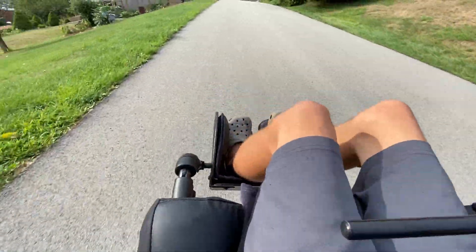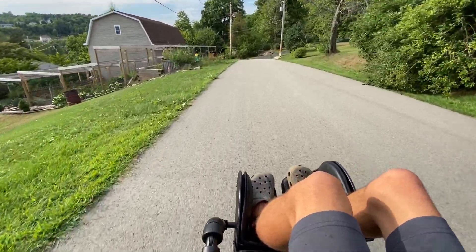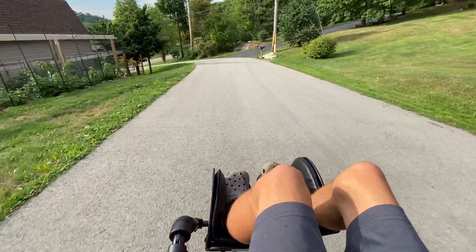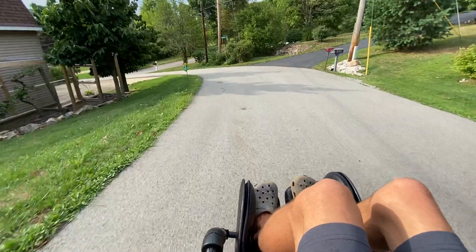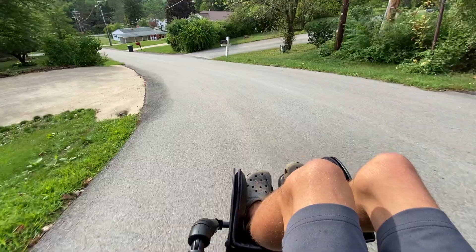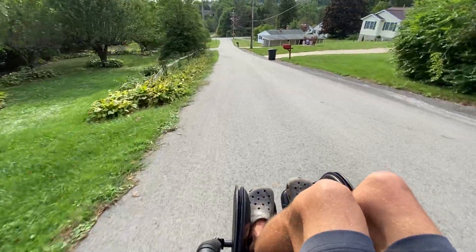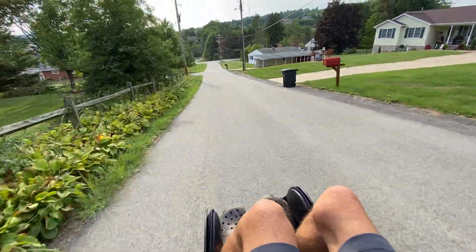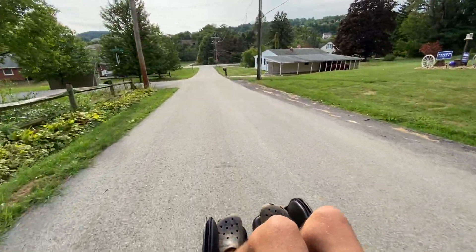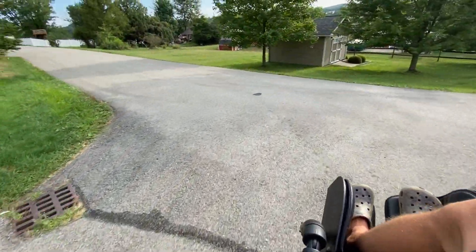Although you do have a seatbelt, I just don't have it on right now. We're about to go down one of the steepest hills I've ever seen. You can hear it's trying to electronically brake. This is actually where I clocked it — not 7.2, but 8 miles an hour going down this hill. So the absolute maximum speed on this thing is 8 miles an hour, which is amazingly fast for a power chair.